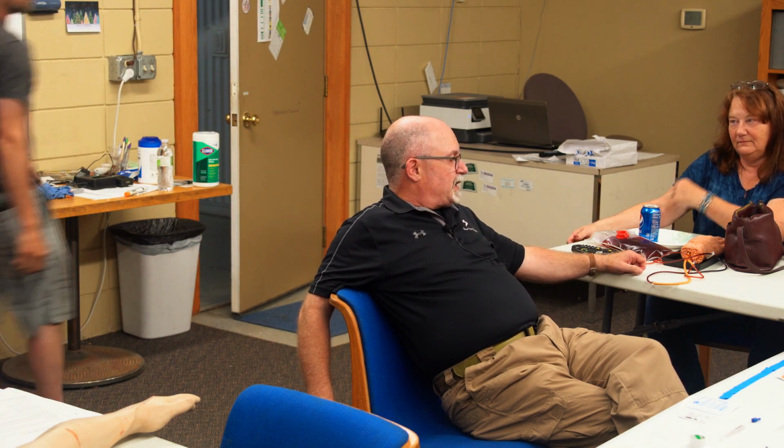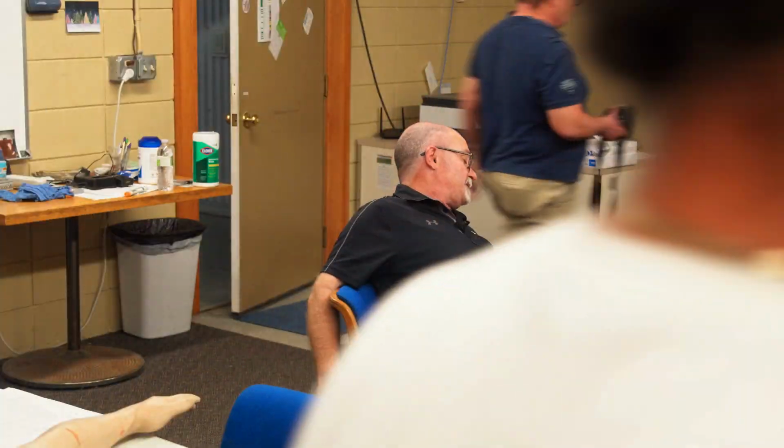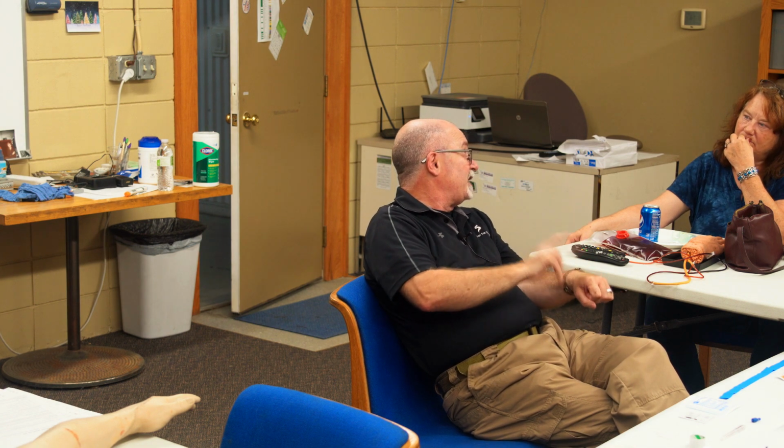There's a couple of techniques you can use to help veins pop out. One is get the tourniquet on and get the extremity lower, so you've got gravity working for you. Have them hang it over the edge of the cot. Sometimes you can do a warm pack, or just hold your hand on it to warm things up. That'll help. Another one is you can just tap and irritate the hell out of it.